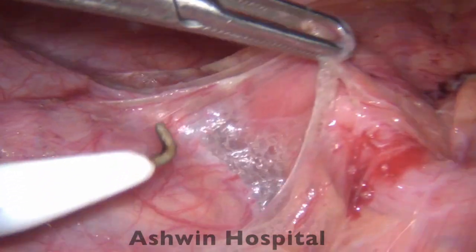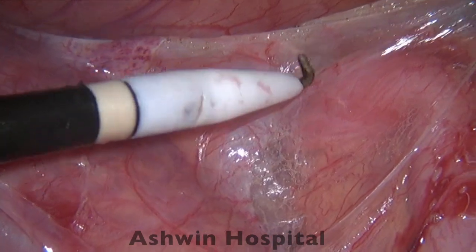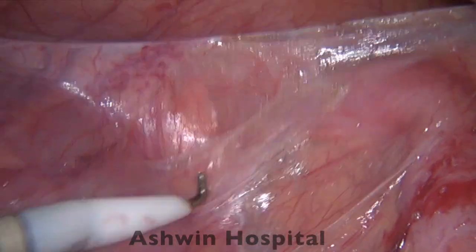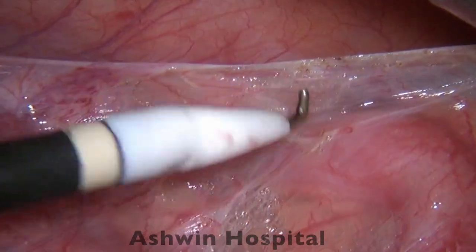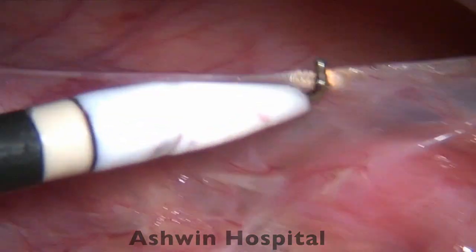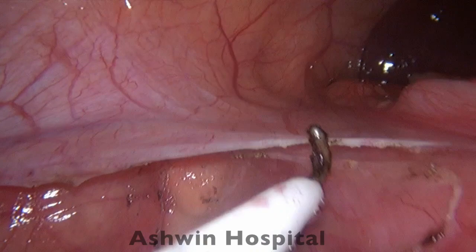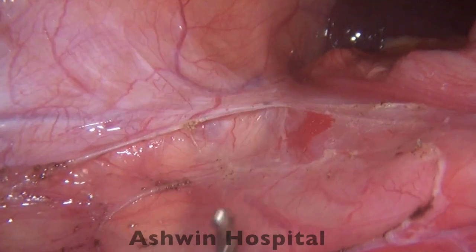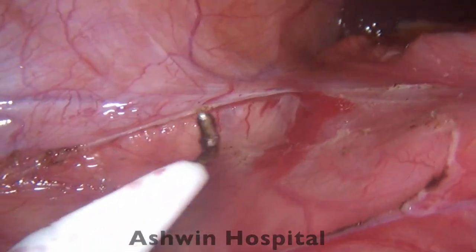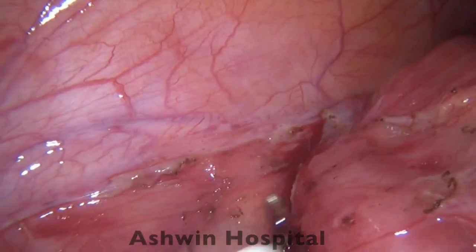It is only after opening the lateral attachment of the peritoneum and the retroperitoneum that we are able to appreciate the exact location of the appendix. This is very crucial whenever we have a retrocecal appendix or one almost extending up to the subhepatic region. Using cautery, the fold is gradually incised and we have come very close to the liver. Based on the exact location of the tip of the appendix, we may need to dissect to an adequate level.